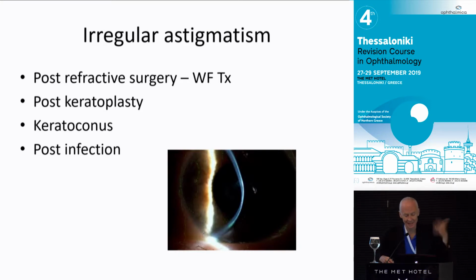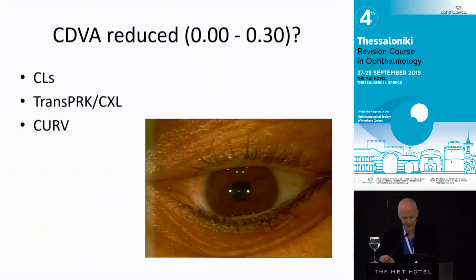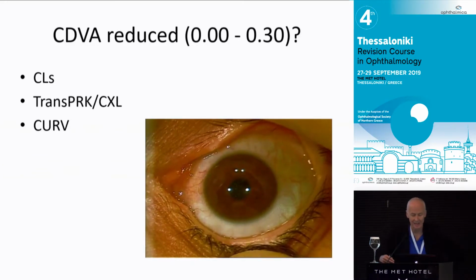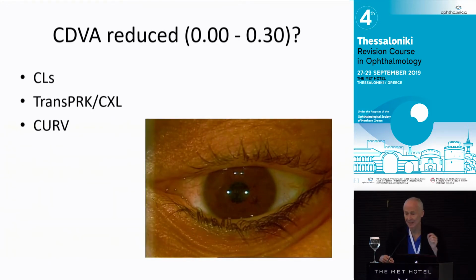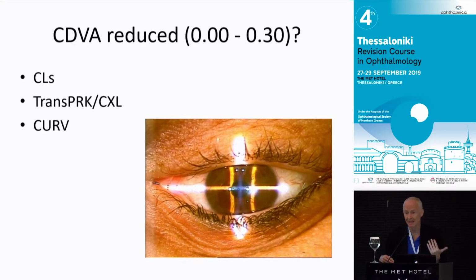Irregular astigmatism, let's remind ourselves these are the common causes. And remember, we're not going to do gross adjustments with the laser, we're only doing the fine tuning. This would be a typical example I'm going to set up here, which is how we treat keratoconus with early visual loss. Again, you can photograph this slide if you're interested in going over this in more detail. So the question here is, can we use trans-PRK, and I'm just going to show you a trans-PRK treatment here, almost live, to help reduce irregular astigmatism in cases presenting to you with keratoconus and visual loss in one eye.